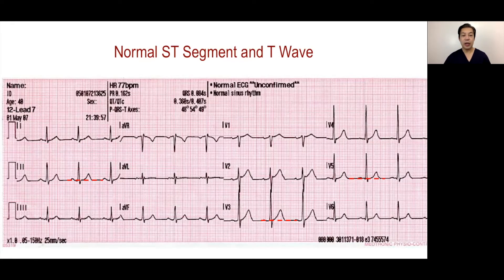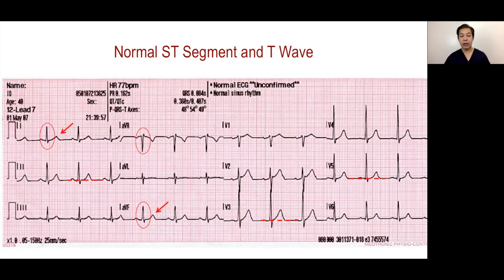In general, the T-waves will have a polarity similar to the net polarity of the QRS deflection. So if lead 1 has a net positive polarity, T-waves should be positive as well. That is similar with AVF, hence a positive T-wave in AVF, which is normally positive. AVR, on the other hand, records a net negative QRS, hence a negative T-wave. The lateral pre-cordial leads record positive T-waves as well.